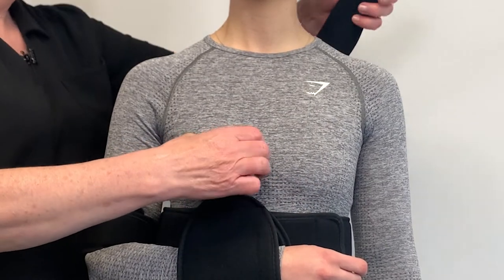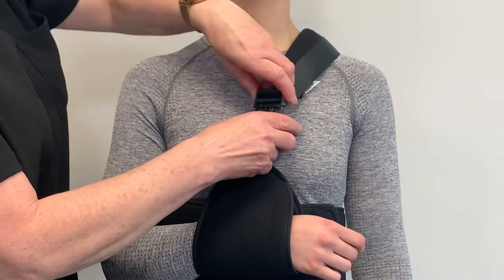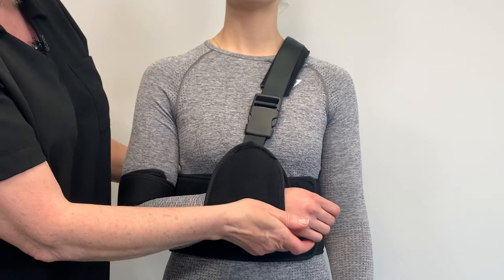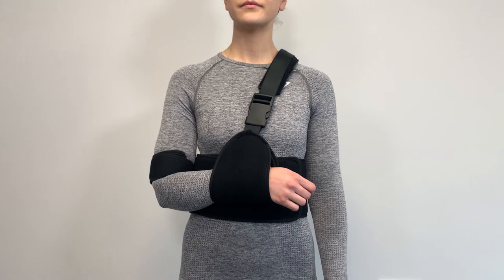Run the shoulder strap over the unaffected shoulder and clip it to the wrist cuff. Tighten the shoulder strap until the affected arm no longer requires supporting and fasten securely with the hook and loop to the shoulder strap.